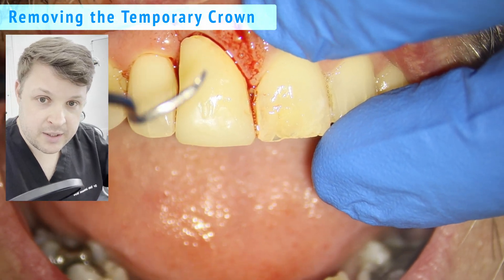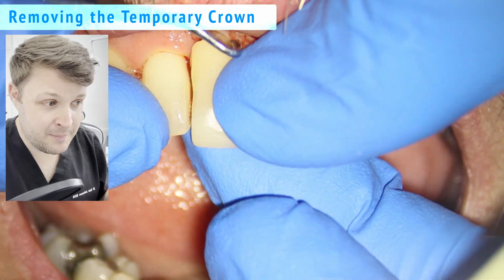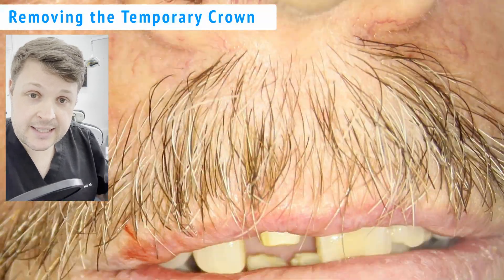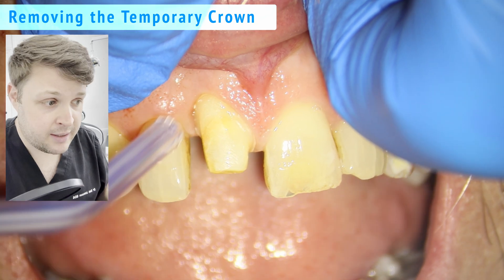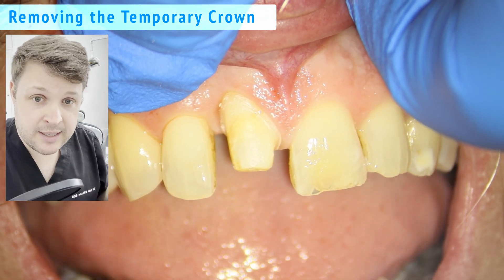Here I'm going to remove the temporary crown — there's quite a lot of blood there. Luckily in this case I didn't have to remove much temporary cement from the temporary crown.